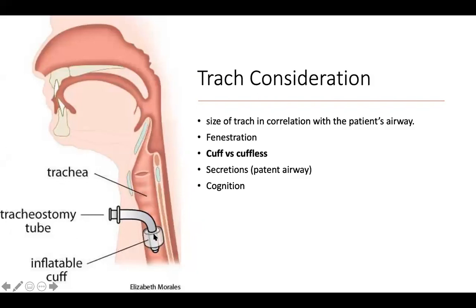Is to have enough space around the trach to allow the air to escape to the upper airway when the patient is exhaling. So if you put the speaking valve here, patient is inhaling, and then patient is exhaling, and you have that cuff fully inflated, then the exhaled air cannot escape to the upper airway. And the exhaled air will be causing CO2 retention. It means it will accumulate over here, and patient might actually suffocate. So there are so many things that could cause the air not to escape freely to the upper airway.